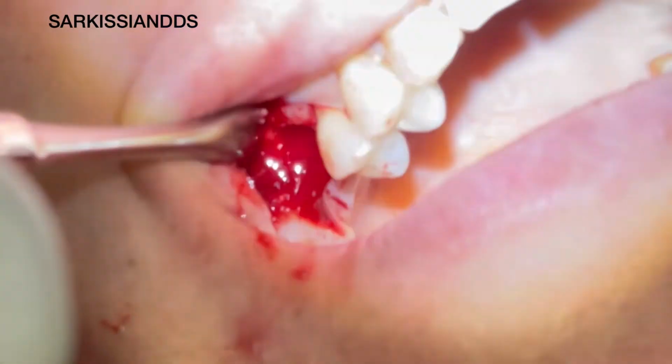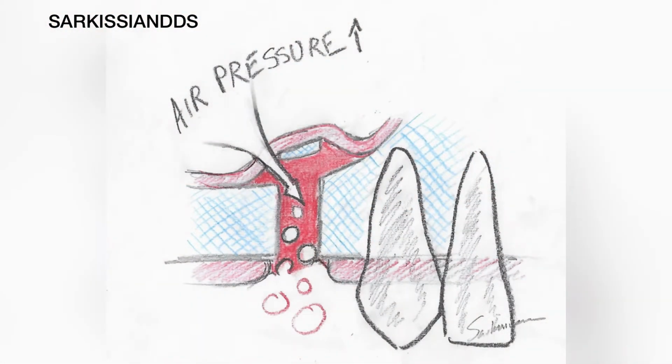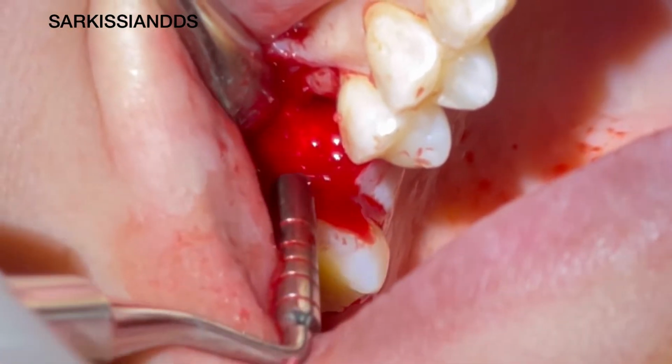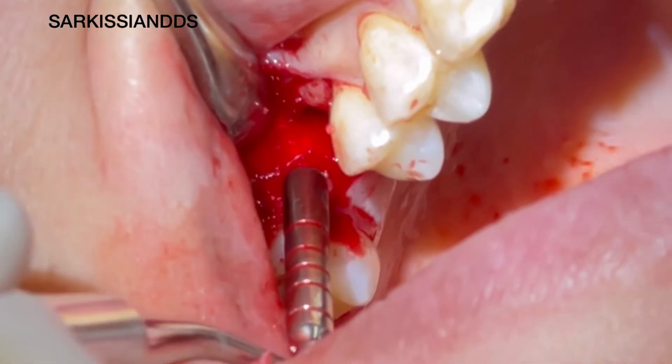To make sure we don't have a tear in the sinus membrane, we have the patient blow into the sinus while we pinch their nose. This is done a few times. If bubbles appear through the socket, that means the membrane has a tear. In our case, there were no bubbles, just blood welling up due to the pressure from the sinus membrane. A second method to test is to use a thick probe and gently push on the base of the socket, which will rebound like a trampoline, and a certain resistance will be felt.